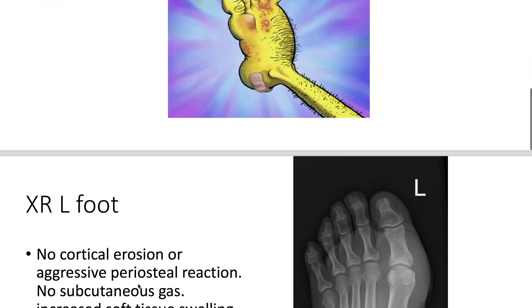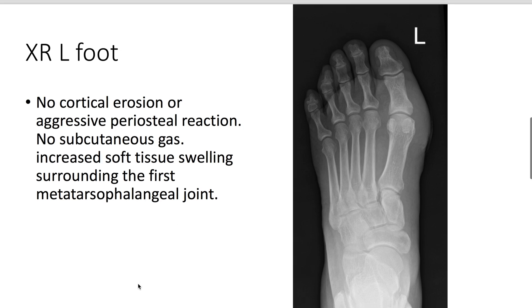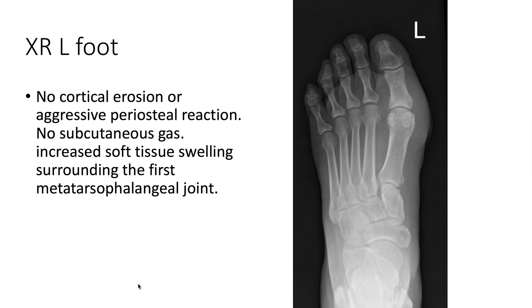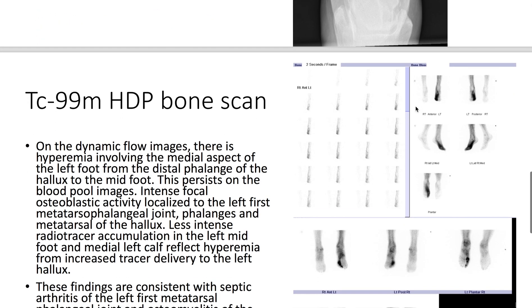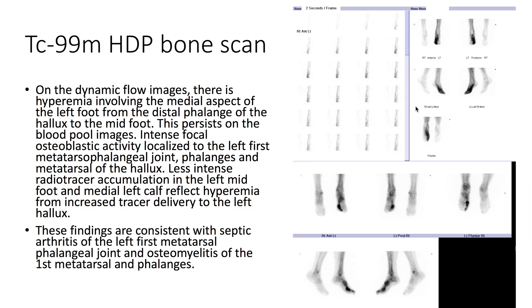Taking a look at the X-ray of the left foot, there are no cortical erosions or aggressive periosteal reactions, no subcutaneous gas, but there is increased soft tissue swelling surrounding the first metatarsophalangeal joint.